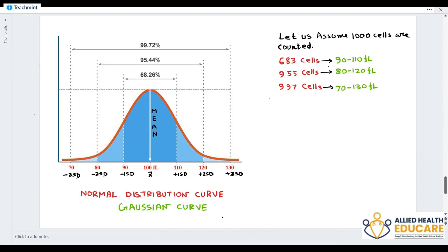When you prepare an LJ graph for internal quality control, you have to rely on this type of normal distribution curve. Actually, the normal distribution curve is represented by the LJ graph.